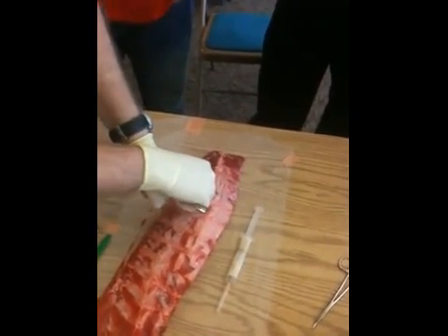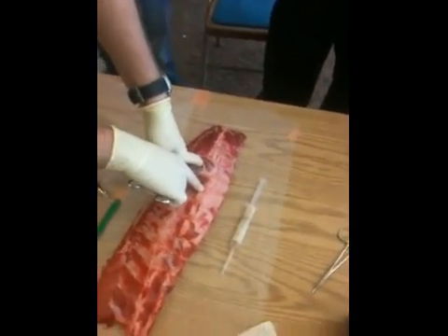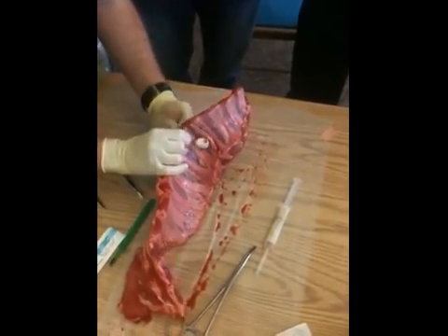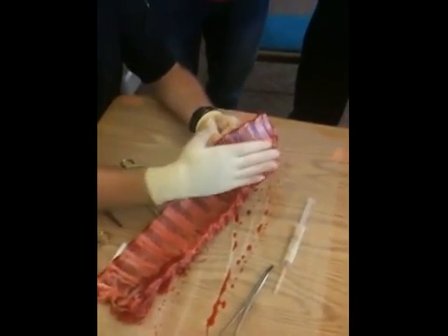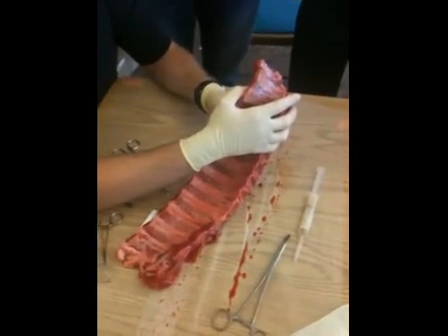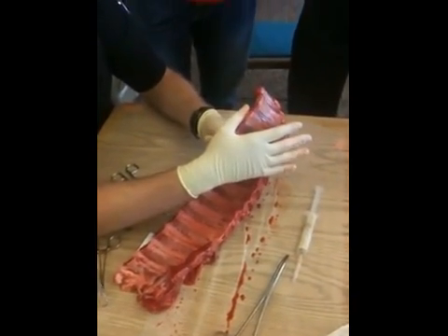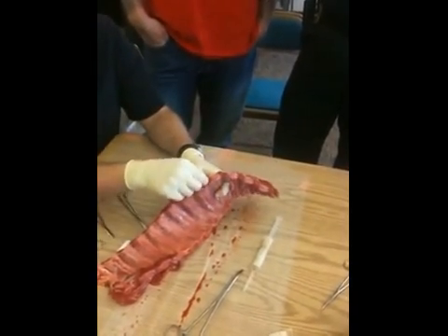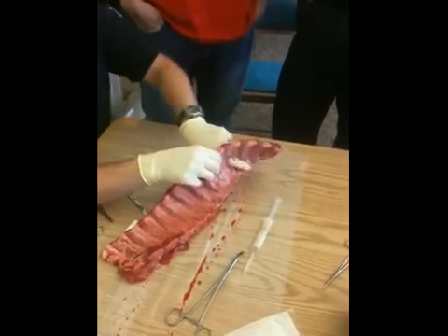After you've tunneled and made your hole, there's a little debate on whether to stick your finger in there. I actually do — I want to make sure. I'll pull the clamp out and take my finger in. I should feel the smooth pleura and really shouldn't feel anything else in there. If there is some air, you won't feel much of a lung, but you may feel a little tissue. If I'm on the right side and I feel something firm and smooth that I can push away — that's a liver. Bad news there. I feel around, and if there are any adhesions, they'll feel like a tendril of tissue. You just kind of break it up and make sure your path is clear.